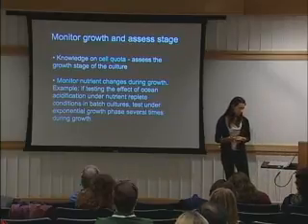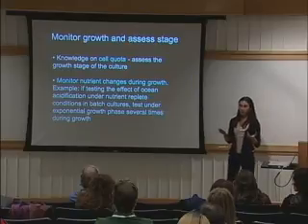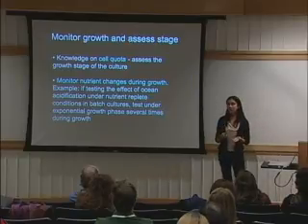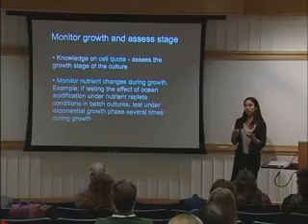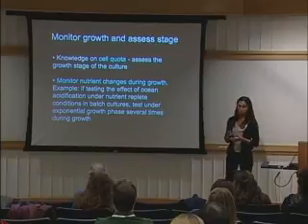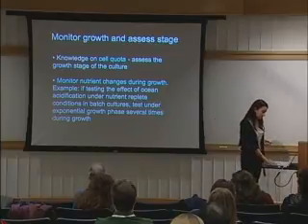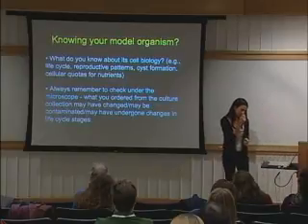So it's very useful to monitor nutrient changes during growth. And this is particularly important if you have a change in the life cycle within your culture. For example, if you suddenly get formation of gametes, you might have a change in the nutrient utilization or in the carbon utilization in your media. So you need to know these things. And the best thing you can do is run these experiments in advance and get these numbers way in advance of your experiment.